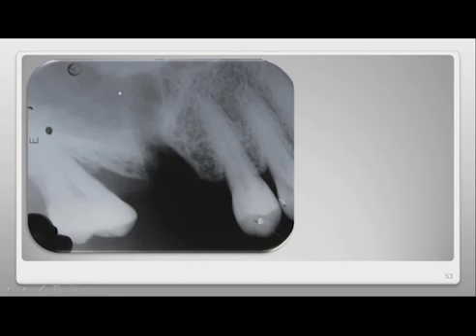Here we can perfectly observe in the area that there could have been a risk. This was the site. Obviously we can observe the size of the lesion and the alveolus, and this area is where apparently, I know from clinical tests, no communication occurred, because in addition to rinsing the alveolus with saline solution, it is obvious that if there had been a hole, the patient would have immediately had liquid escaping from his nostrils. All tests indicate that there was no marked perforation. We prepared for any handling while packing the material, etc., to avoid this infection and communication.